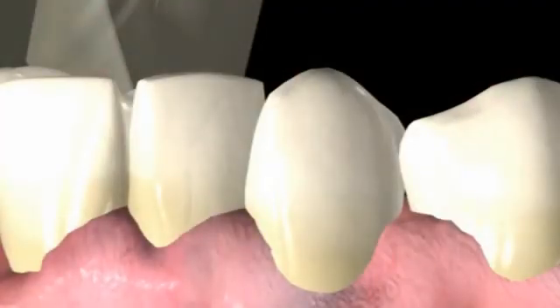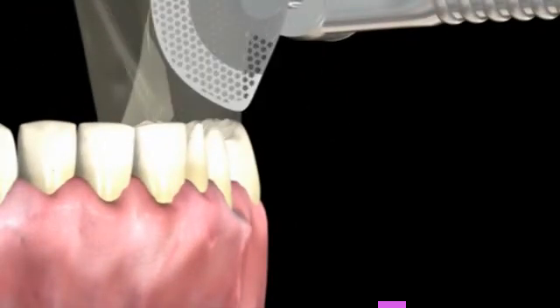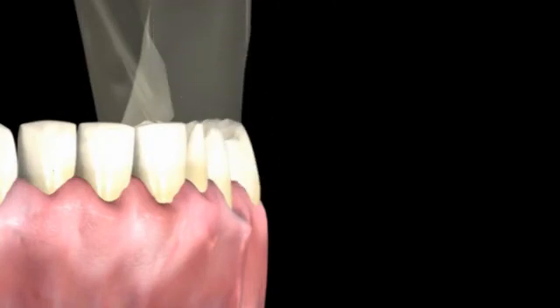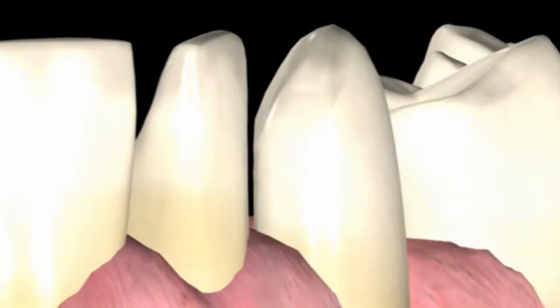A rotated tooth many times presents a challenge of damaging the adjacent tooth when preparing for veneers or full crowns. The OS system allows the practitioner a safety net by using the cutting side of the disc to open the contact, while the non-cutting side protects the adjacent tooth.